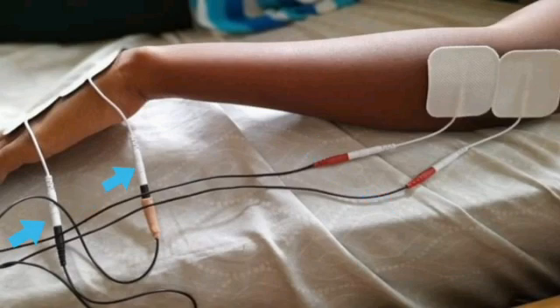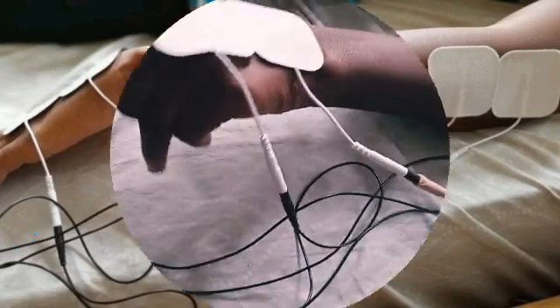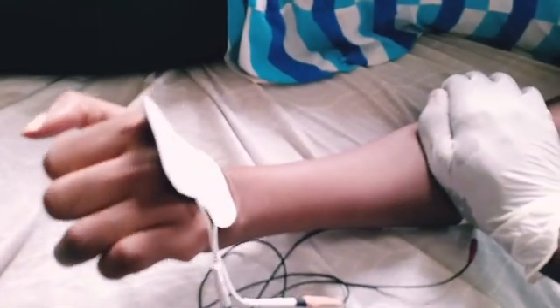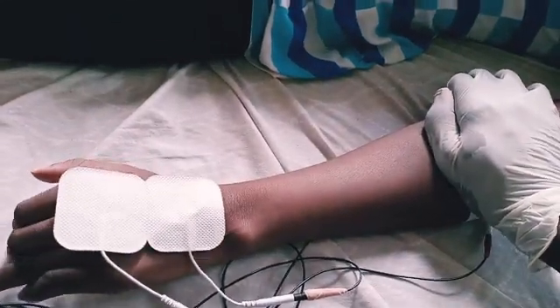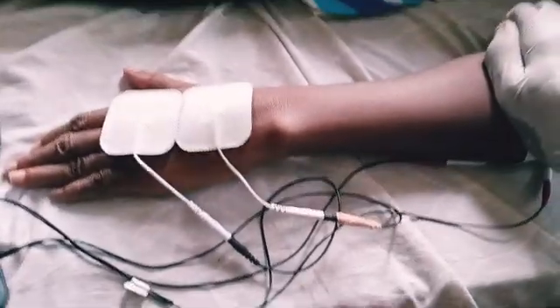Remember that using four electrodes creates a larger surface area for the stimulation. Stabilize the forearm, or if possible, flex the elbow to about 90 degrees for the whole session.